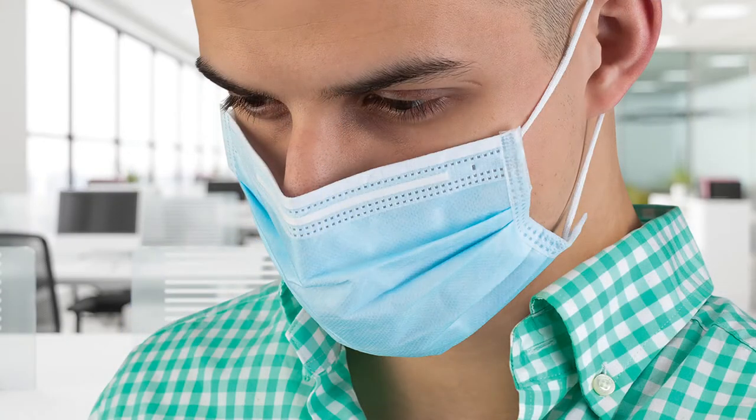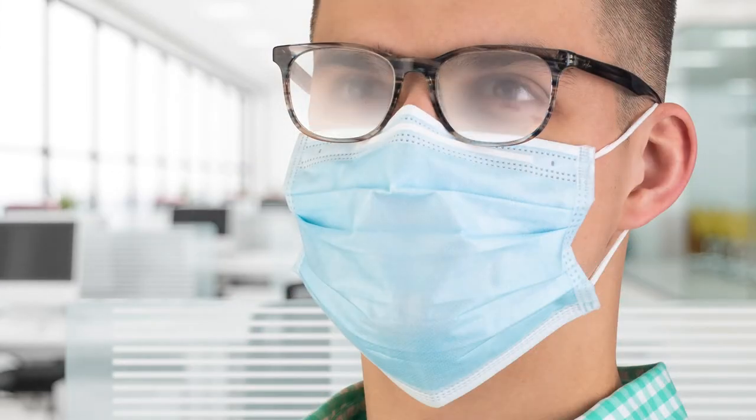Whether disposable or reusable, we all know that even the best masks leave gaps around your nose that reduce filtration quality and cause eye fogging, and masks often slide around further limiting their effectiveness.